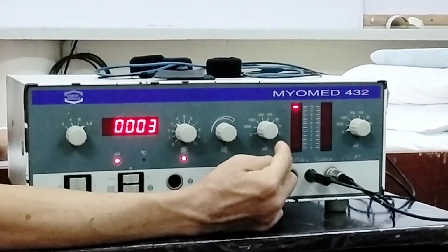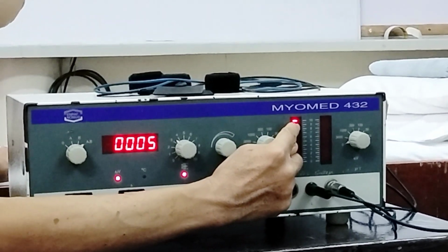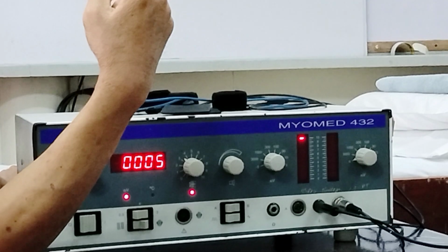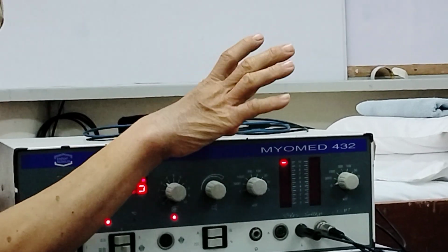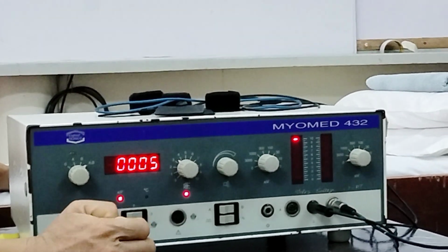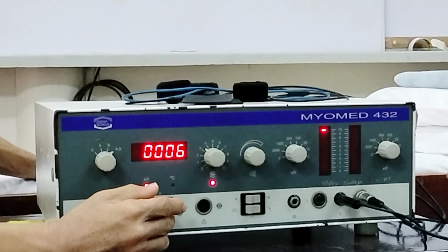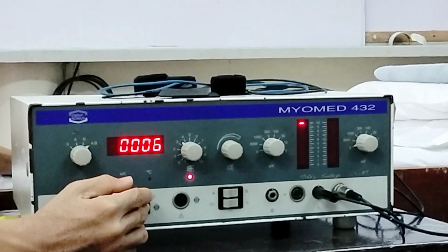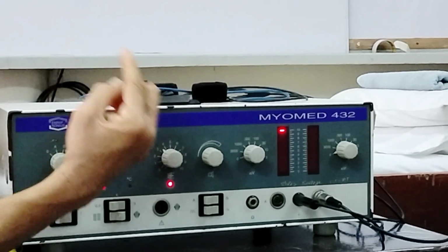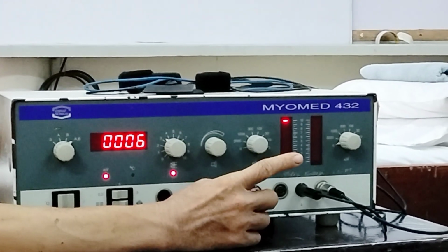Even without the motor unit structure, signal is picked up, and this signal is from the surroundings. As we mentioned, your modality will not only get signal from your motor unit structure, but also from other sources such as electric fan, air conditioning, and other appliances. As we mentioned, those are artifacts. So right now the reading is high because it tends to pick up signals from the surroundings. If you place it at 3, the machine is very sensitive.